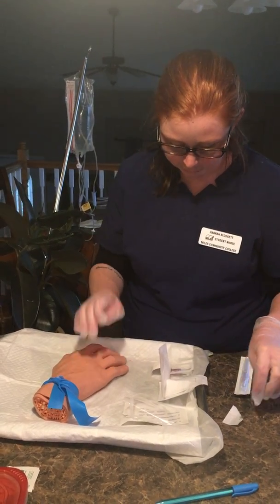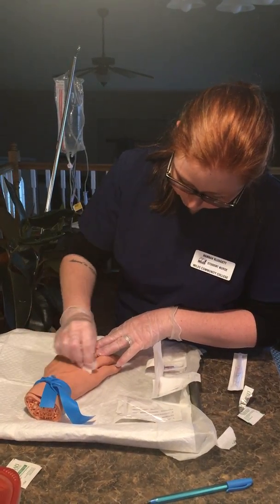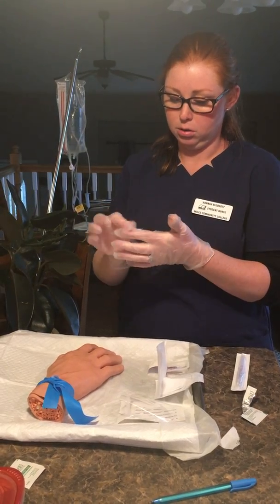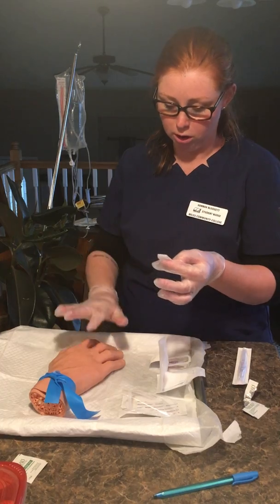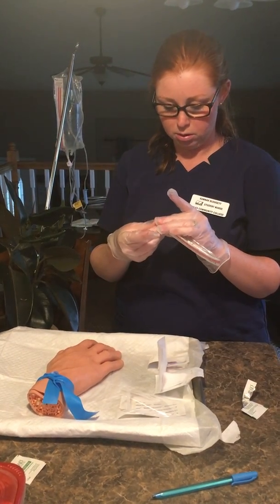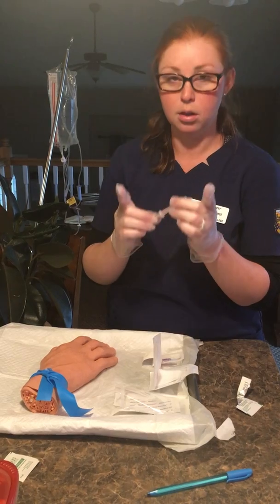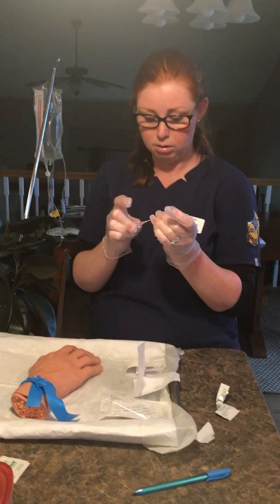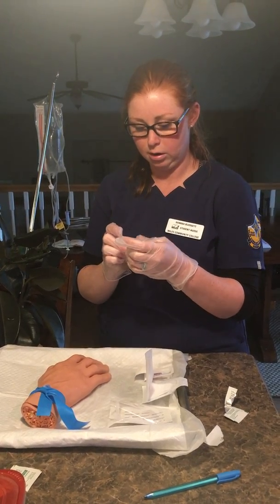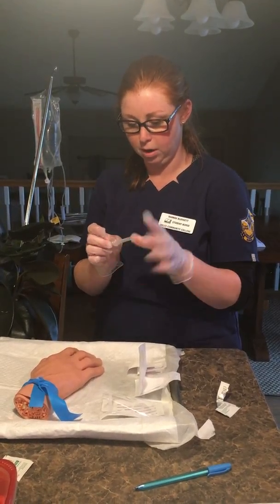I've identified my spot. I'm going to use an alcohol wipe to get that area nice and clean. Something handy I learned from my phlebotomy clinical: wipe off both ends of your fingers so those are still clean and you can anchor the vein. With the catheter, I want to make sure I've loosened the catheter tip a little bit so I can advance it easier after I get it placed. Then I'll go ahead and uncap my needle.